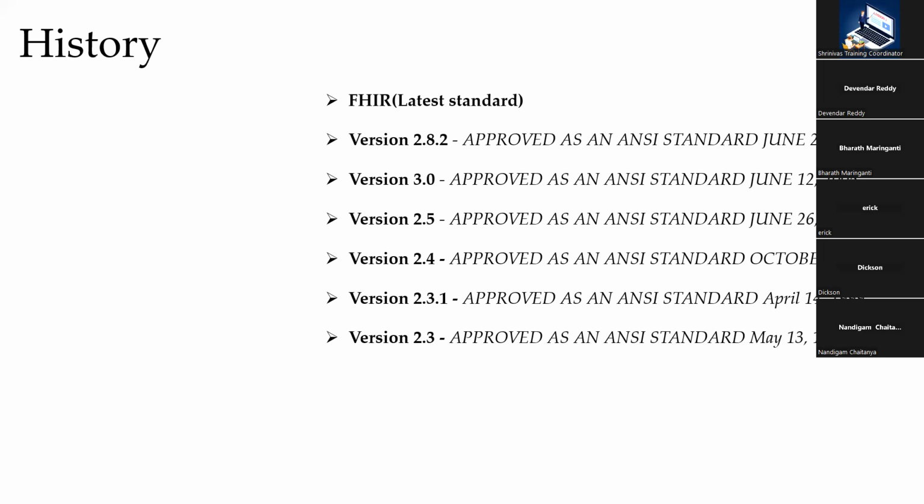Okay. But FHIR has plans to replace HL7v2. They have mechanisms or paradigms, but that will take a very, very long time, right? Replacing a 30-year standard, 35-year standard, just like that is not possible, right? So FHIR is still evolving.